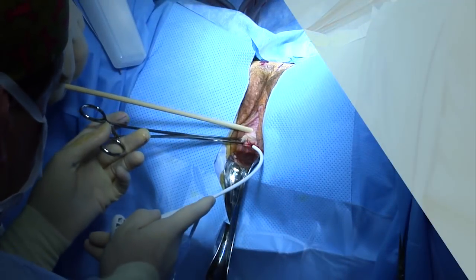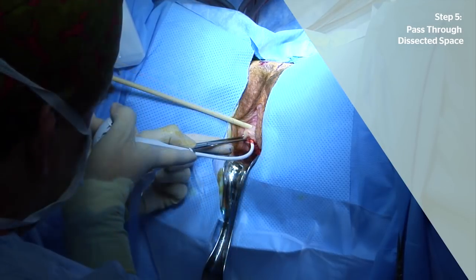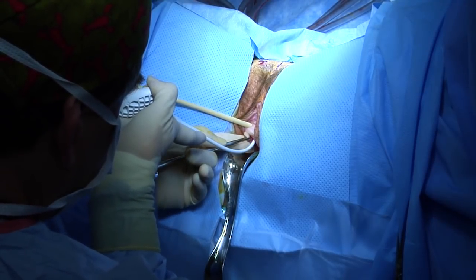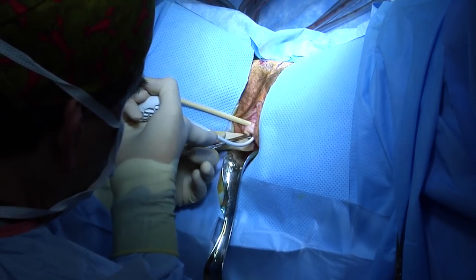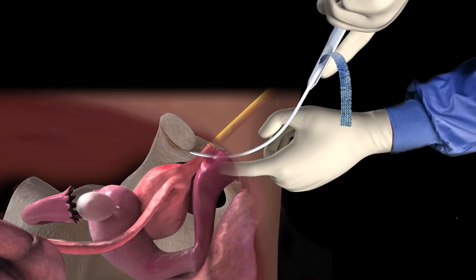Begin the insertion by holding the trocar handle in your dominant hand. Control the initial insertion using the non-dominant hand by placing the index finger in the vagina under the anterior vaginal wall, just lateral to the suburethral incision. Orient the trocar sheath tip horizontally in the frontal plane during the initial submucosal passage in the paraurethral dissected space. Pass the tip of the trocar sheath until it has reached the end of the dissected space.